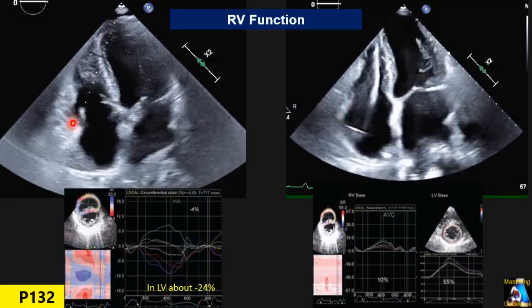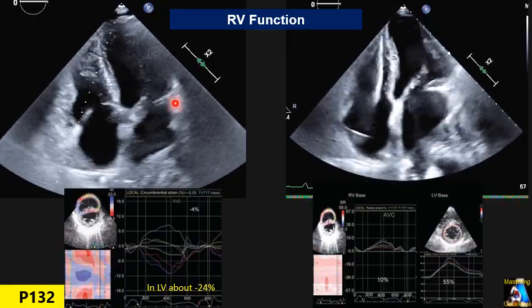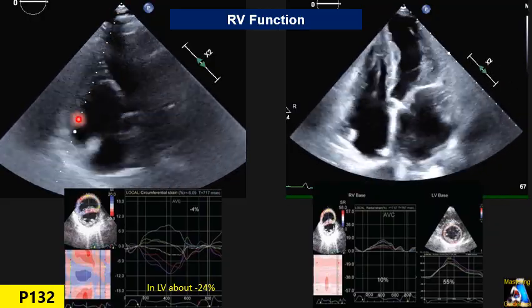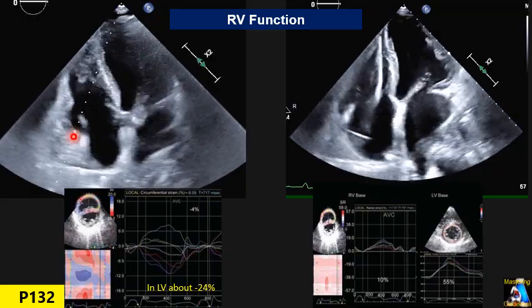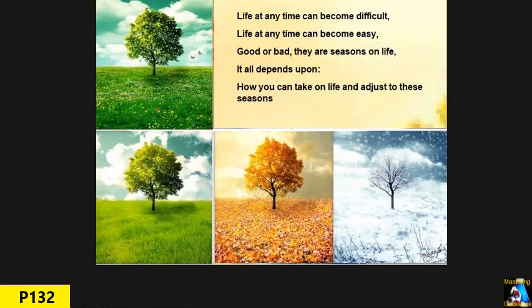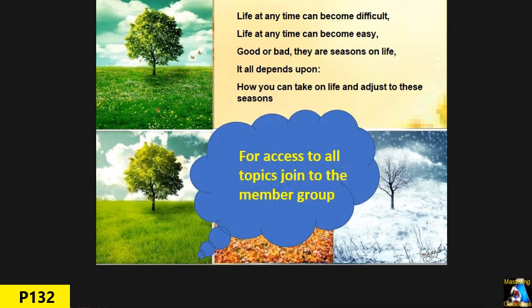You can estimate RV systolic function by comparing the excursion of the tricuspid annulus toward the apex — measured by TAPSE and TDI S' — to the forward movement of the mitral valve annulus. There are many more topics related to RV function, including myofibril arrangement, which will be covered in a separate lecture on right ventricular function. Thank you, and have a wonderful time.